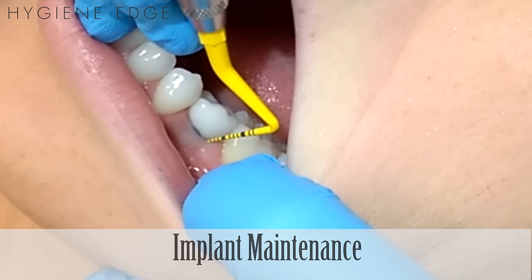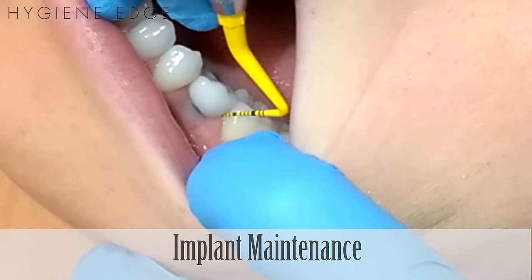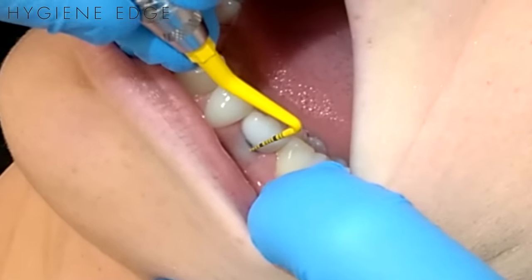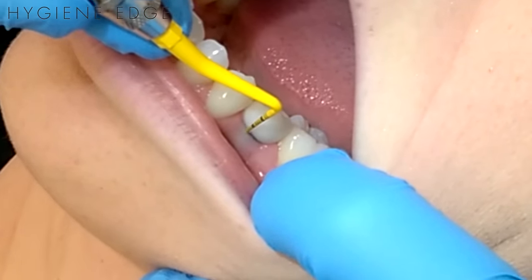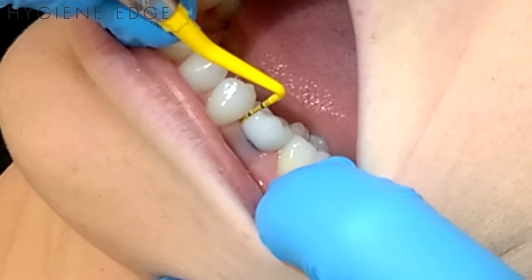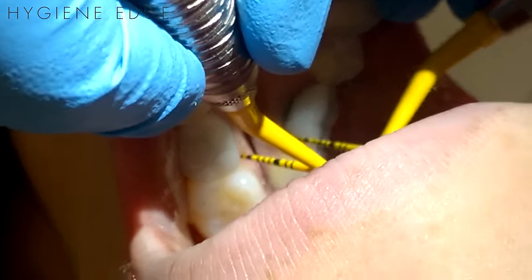You want to probe an implant as if it were a regular tooth, using a plastic probe to prevent scratching it. Remember when probing and scaling to continually adapt as you're working around a circular shaped implant that doesn't have any line angles. And if you see peri-implantitis, it is best to refer the patient back to whomever placed the implant for further evaluation.